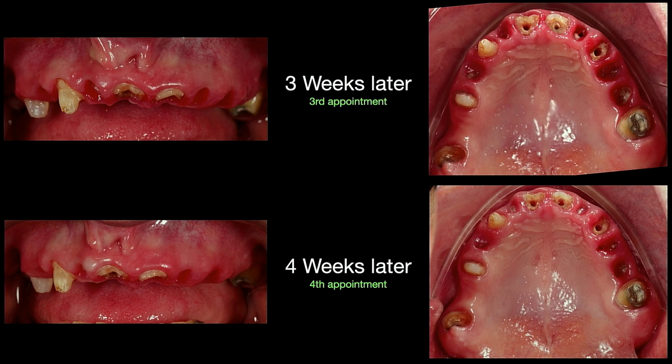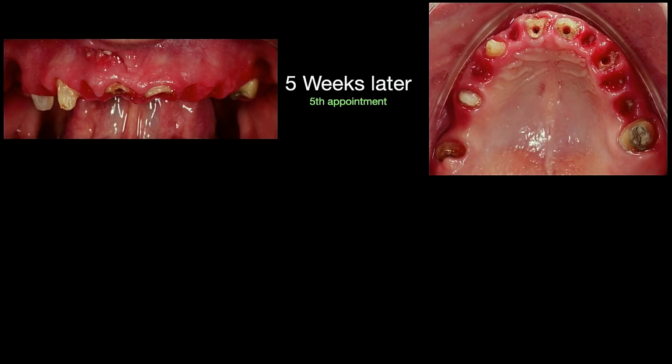Look how interesting this is, 4 weeks later, right? Then here, 5 weeks later, in an occlusal view, you can see the improvement of the tissue. So look here, the patient is already in a quite favorable aesthetic situation, as you can see in this image. She is in a very good aesthetic situation as the patient has regained her self-esteem after arriving with those teeth in that condition, coming loose and breaking. So right here, even before you get to the surgery, you can already give this patient a significant boost in self-esteem because she already feels more confident in smiling, more confident in chewing, in eating. So in addition to all these benefits of tissue management that you are doing for your patient, you also have all these aesthetic benefits for this patient.